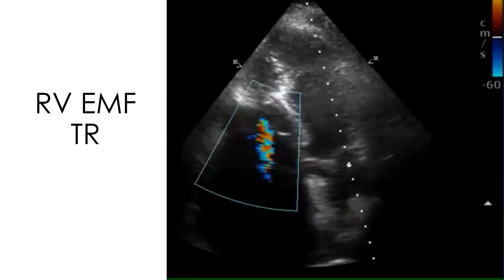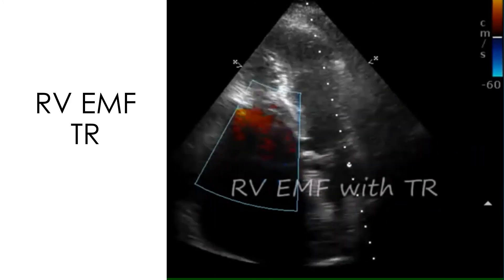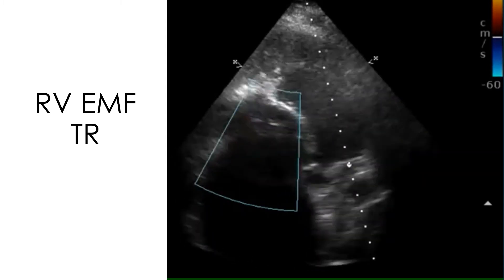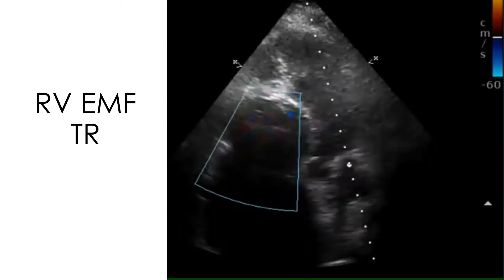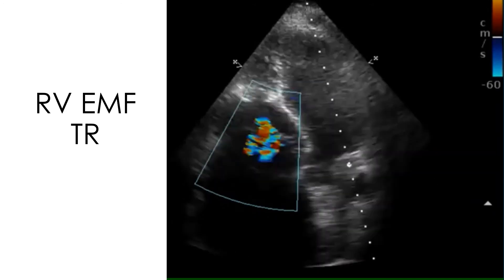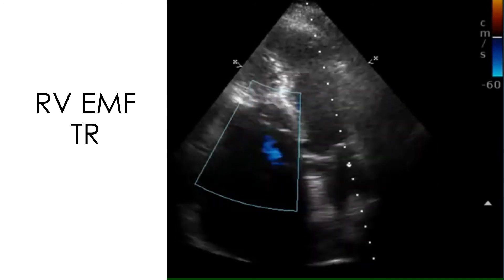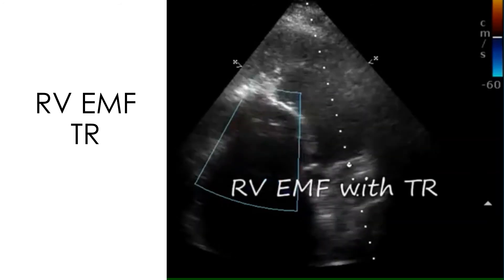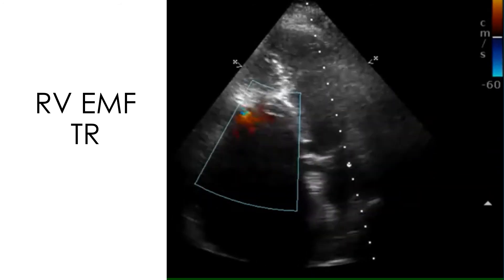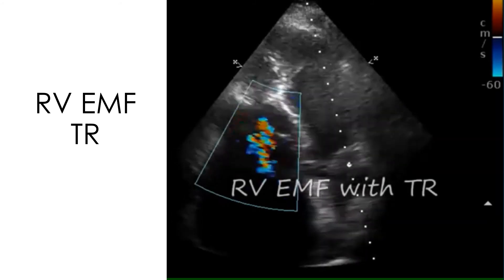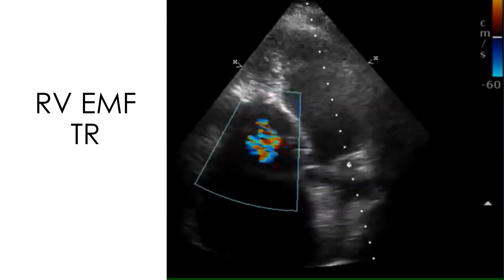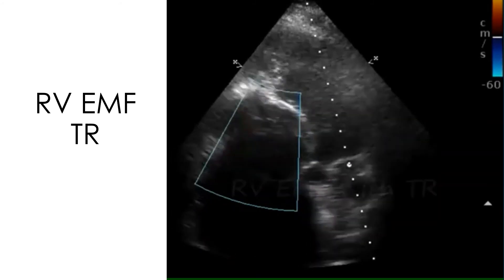Color Doppler evaluation demonstrates significant tricuspid regurgitation. Doppler interrogation will reveal that it is a low velocity TR, unlike in pulmonary hypertension where the TR velocity is high. Even though the TR in this case is low velocity, it shows aliasing and variance with multiple colors because the Nyquist limit of the color Doppler is set at 60 centimeters per second.